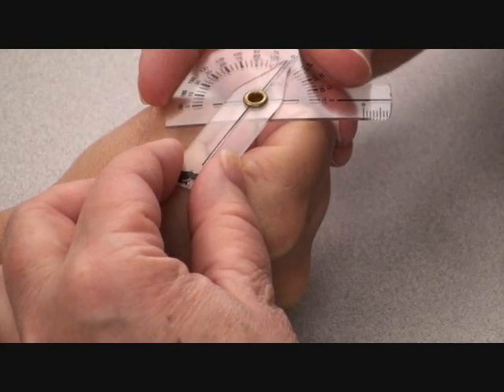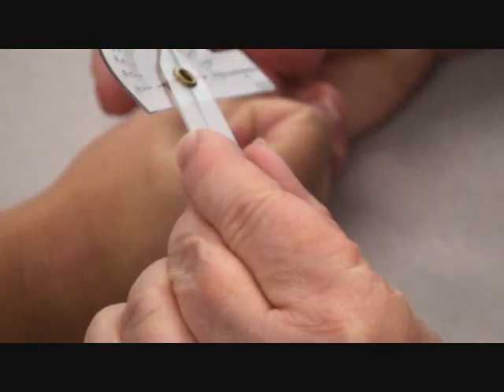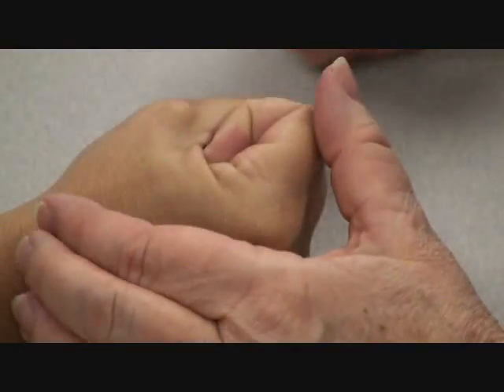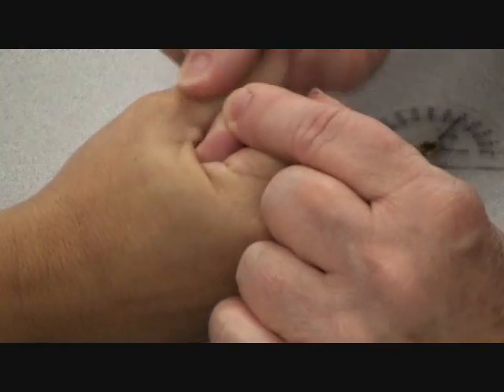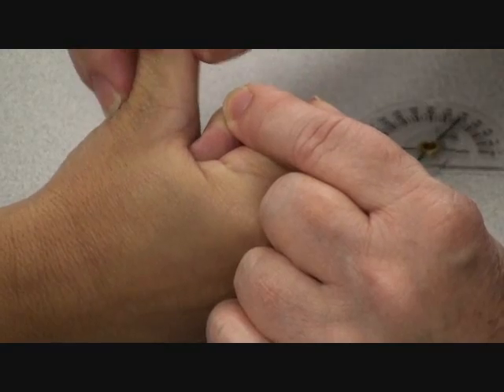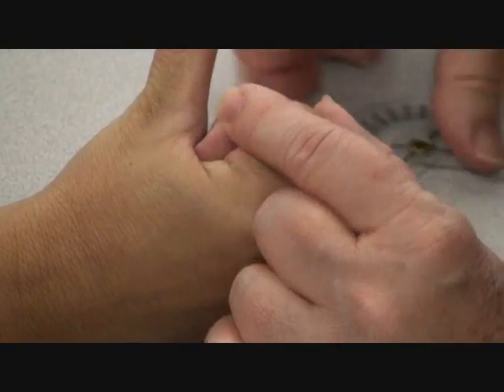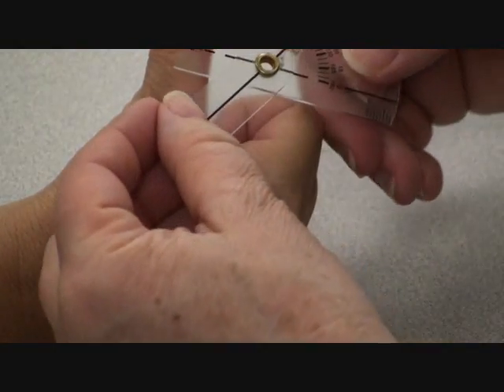And then if I go, yeah, still same, about 60. So sometimes you might have to kind of get them to move their thumb out of the way for you. Or you might not be able to get directly on them. You may have to kind of eyeball it from a slight distance.